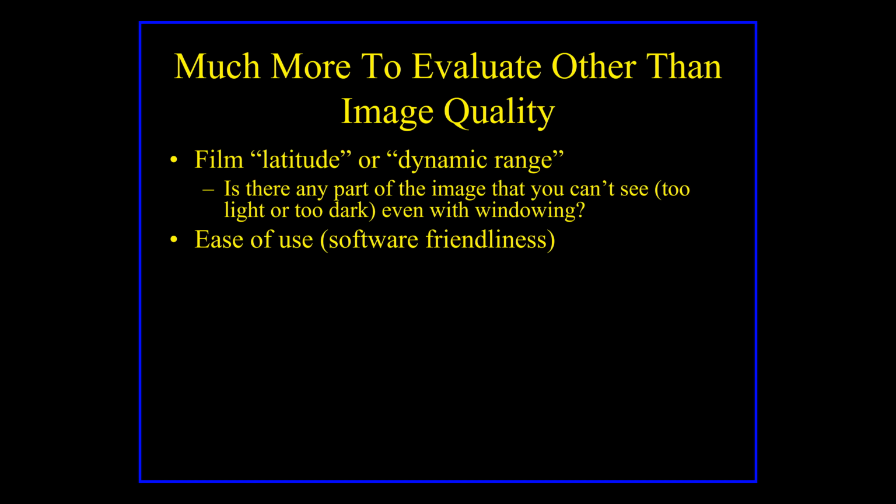When you're evaluating the software, it's just like any other software. It's like PowerPoint or any other thing. Is it easy to use? Is it intuitive? Or is it so complicated you have to take a couple of classes to learn how to use it, and then you forget how to use it? So you want software that integrates with the system and the images to be relatively user-friendly and easy to use. You want to avoid any kind of digital artifacts. One thing that the radiologists discovered when we all went digital is it introduced a whole bunch of new artifacts that we have to watch out for.